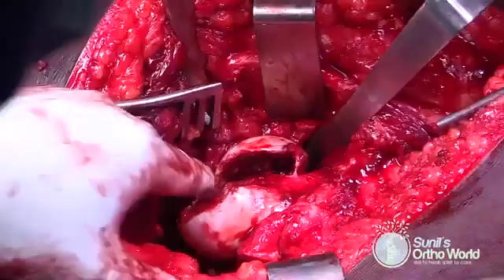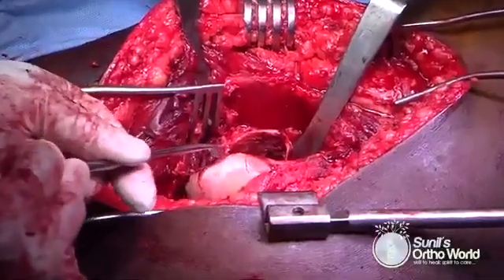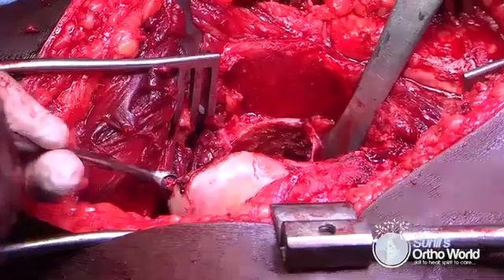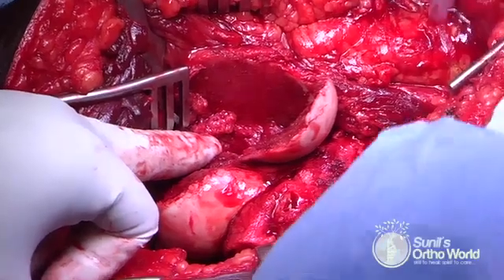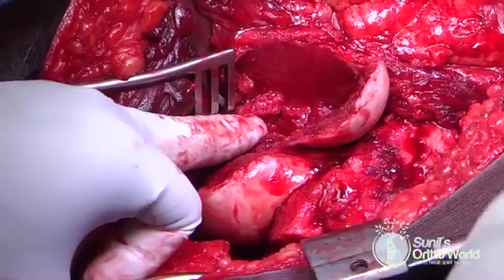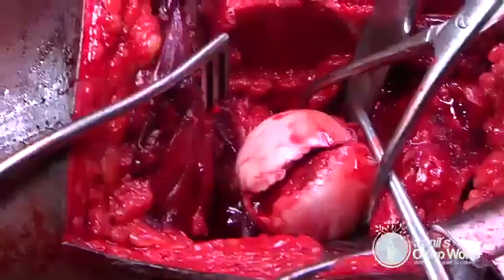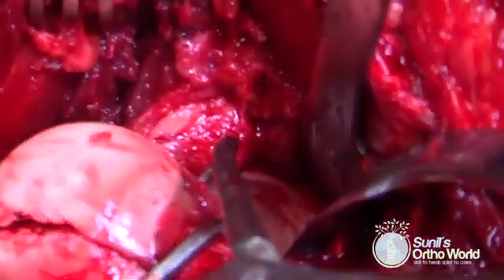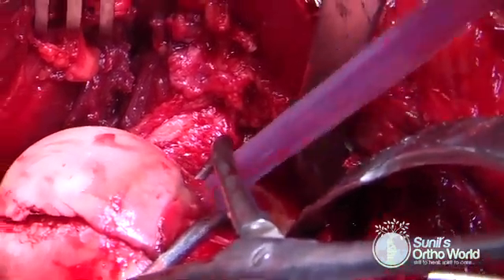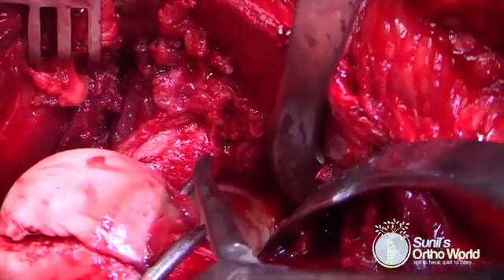The femoral head is now gently dislocated by using a bone hook. The fracture site is completely exposed and the fracture bed is cleared of debris and clots. The fracture is comminuted with a suprafoveal main fragment and a small comminuted accessory fragment on the inferior aspect. The acetabular cavity is inspected for chondral and intraarticular bony fragments, which should be removed. Associated labral avulsions should also be identified and repaired using 3 mm suture anchors.